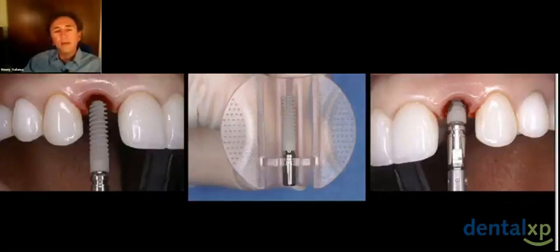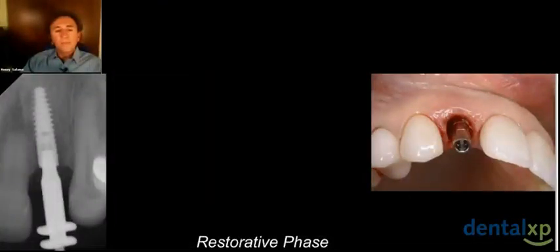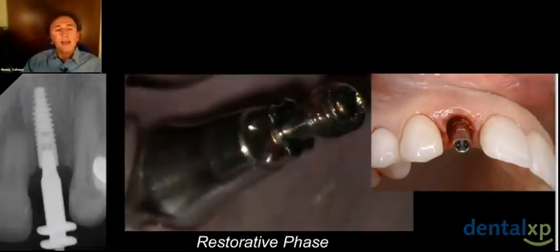So talking about implant design, we want an implant that gives us very good primary stability, an implant that is kind to the interface within that 2-3 millimeters of the crest of bone, so you want progressive threads that don't stress the labial plate, and then a connection, preferably very rigid platform switching that allows us to protect that labial plate. We do subcrestal placement and stay away from that labial plate. You can see, we can also take our final impression at that time.